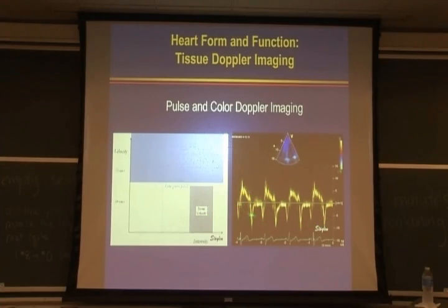So here is the myocardial velocity during systole and diastole. Here is this during systole. Here is the electrocardiogram showing the QRS and ST and T wave, end of systole. During that systole, you have a waveform which is going towards the transducer, which is over here, and we have an upward waveform.